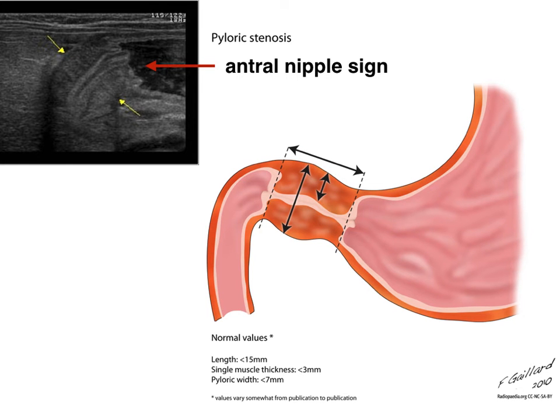So this is the typical one. If there is pyloric stenosis with obstruction, the fluid content will be obstructed. That obstruction can create a window because it contains a lot of fluid, making the contrast better to see the pyloric structures.